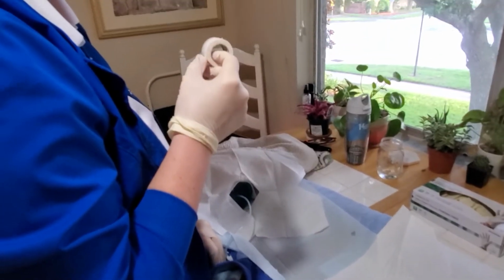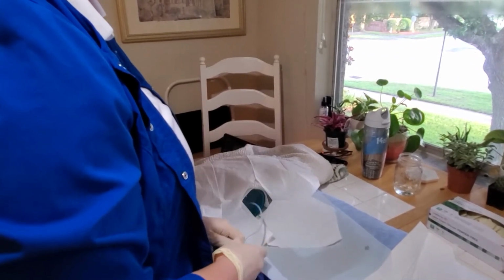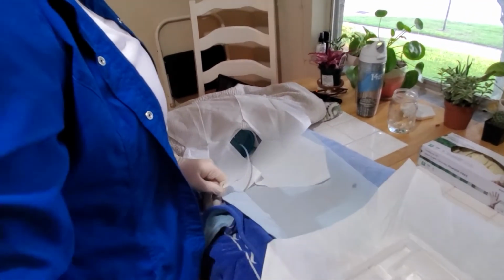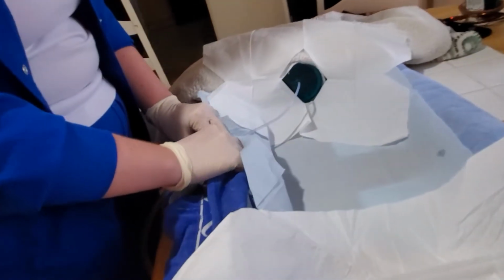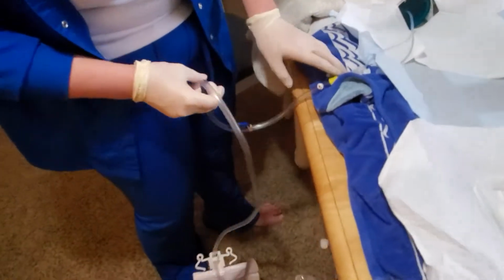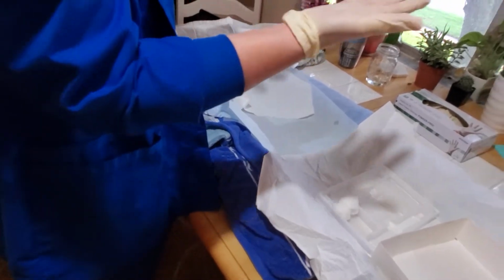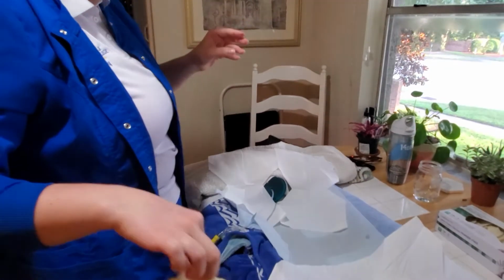The edges always get you. So I'll be attaching this to her leg so that it won't jostle that part. And then the rest of it I will be attaching to the hook under the bed. Right here, using that hook. I will attach it there. And now I can take my gloves off. Discard them. And now I can get rid of my supplies.